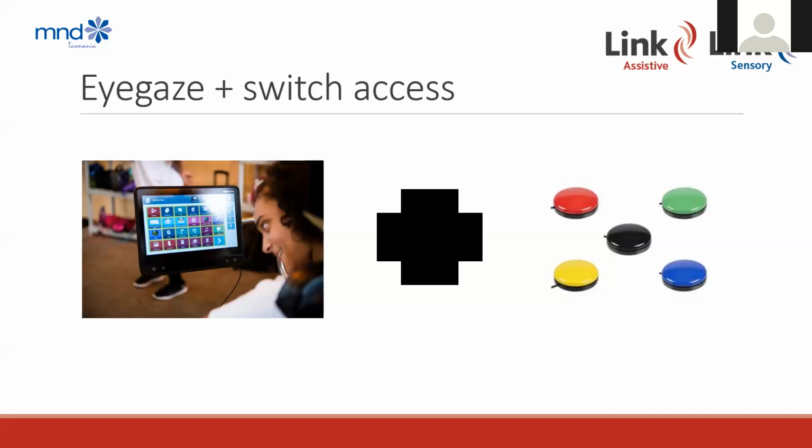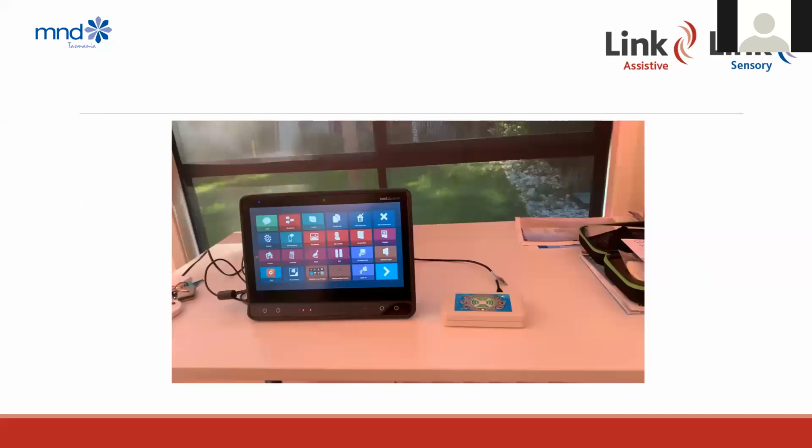And so if there is a suitable switch position, then that can be quite an efficient way for some people to access their computer or device. Some people find the coordination of having to hold their gaze steady and then clicking to be challenging. And some people just find that click movement becomes fatiguing really quickly. And so it might not be suitable for them, but it is definitely an option that's worth considering. So I'm just going to show you a video now of what that looks like.